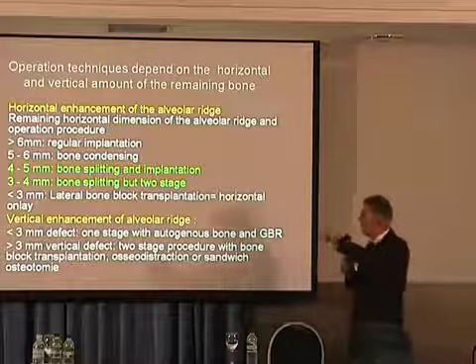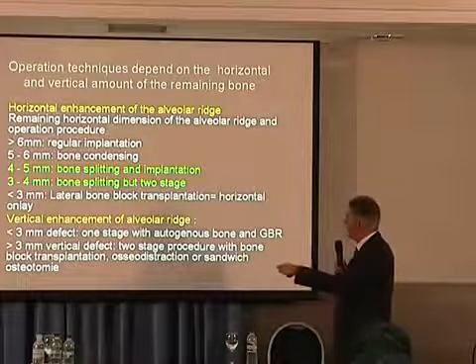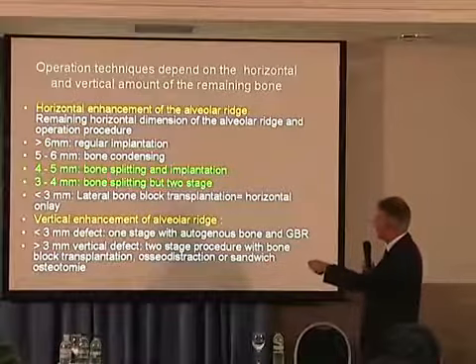So, and here you find a rough guideline how to deal it. Is the bone horizontally 6 mm or more, a regular standard implantation.